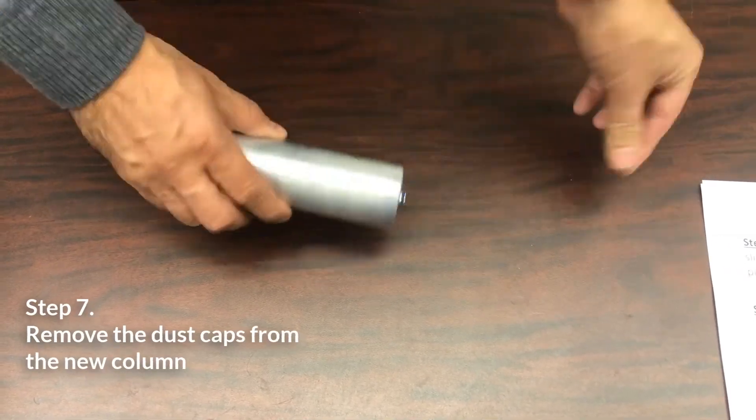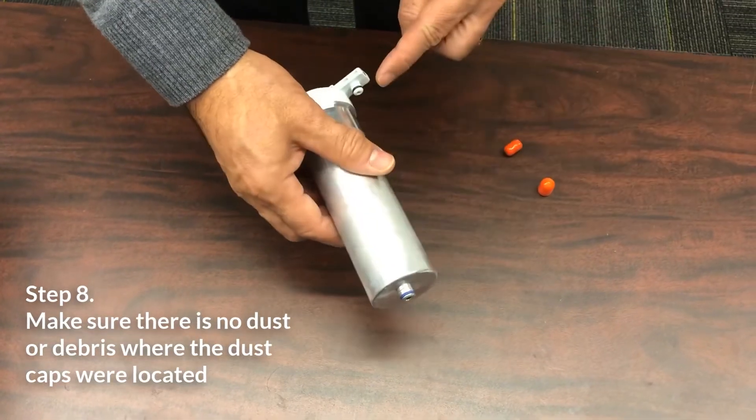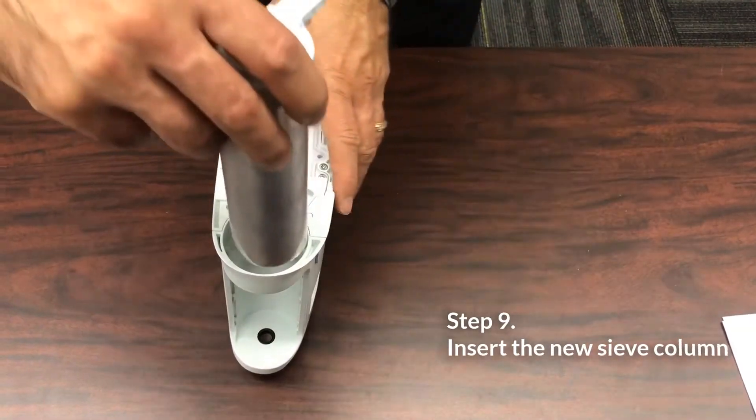Remove the dust caps from the new column. Make sure there is no dust or debris where the dust caps were located. Insert the new column into the concentrator.